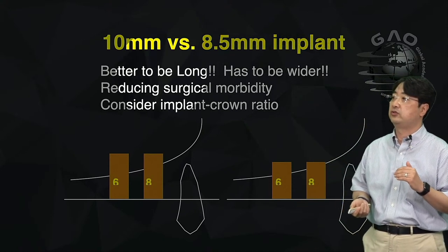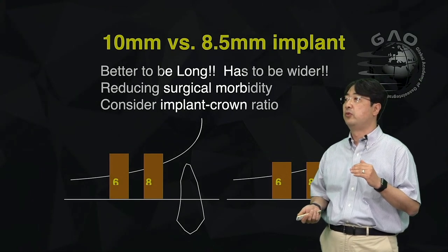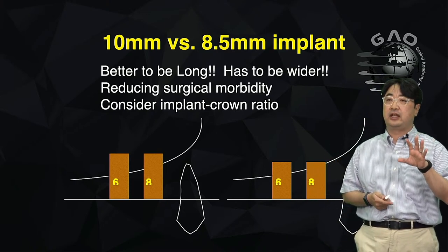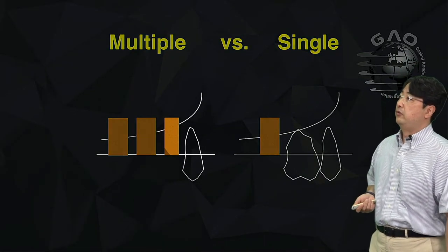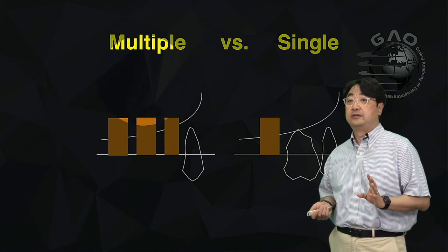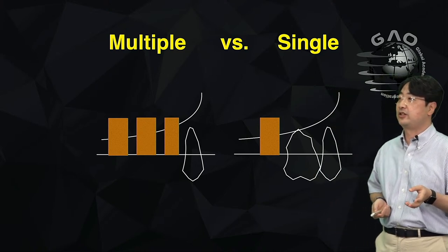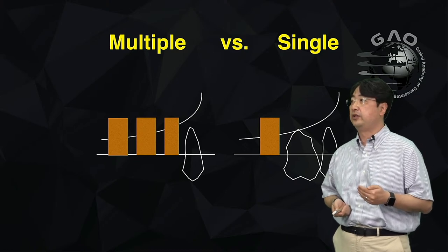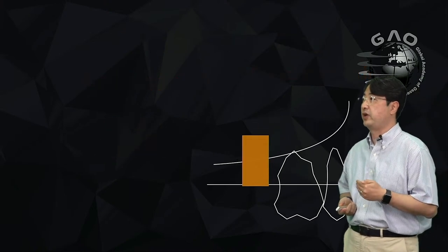Also, you can change the treatment plan from the lateral approach to the crestal approach. Maybe you can reduce the surgical morbidity as well. Still, I mention that we have to think about the space that we have, right? When I do multiple implants, I'll do the lateral approach, then the crestal approach. If I have to do a single implant, I think about the crestal approach first before I do anything. This is the strategy that I have.